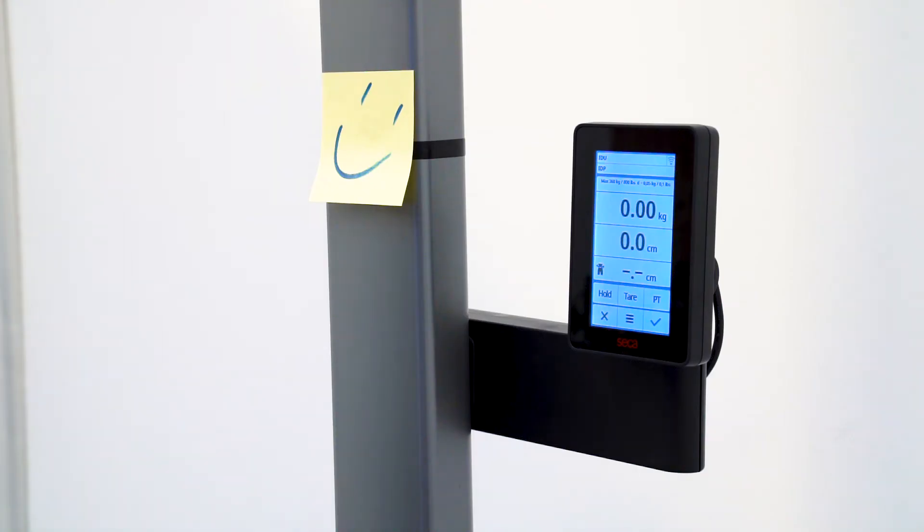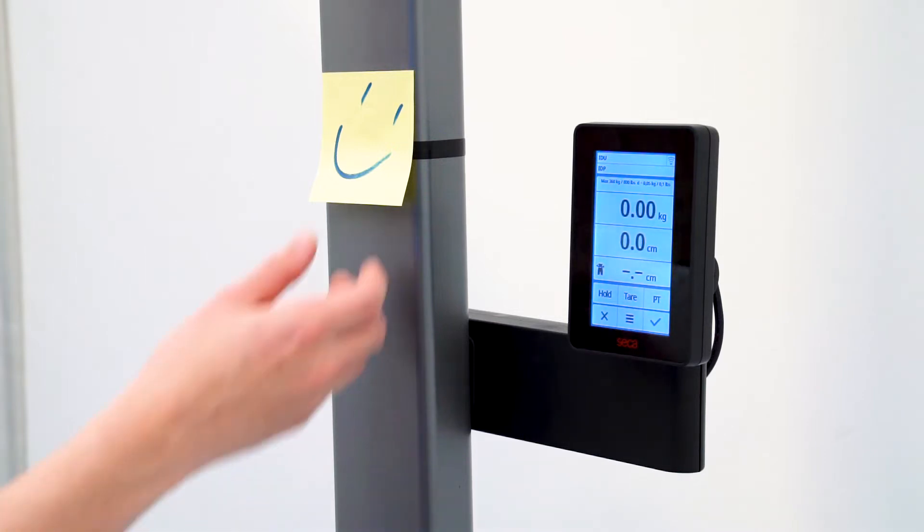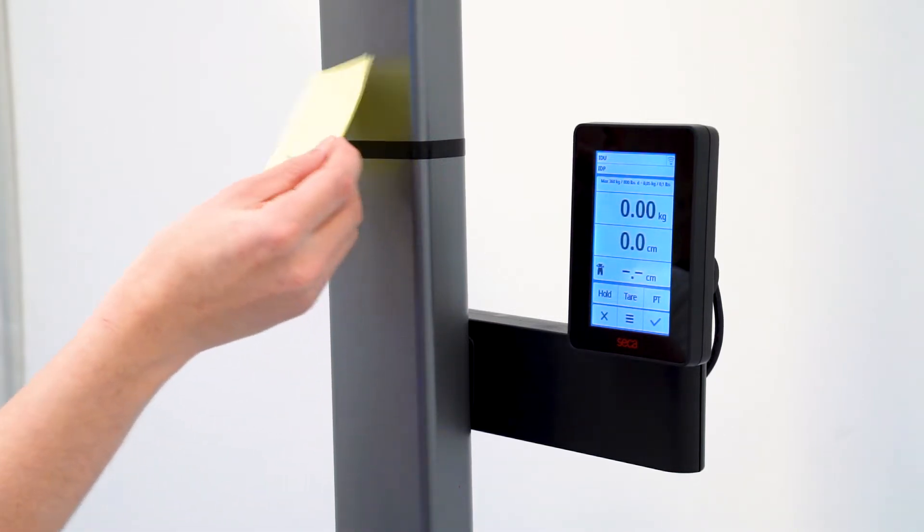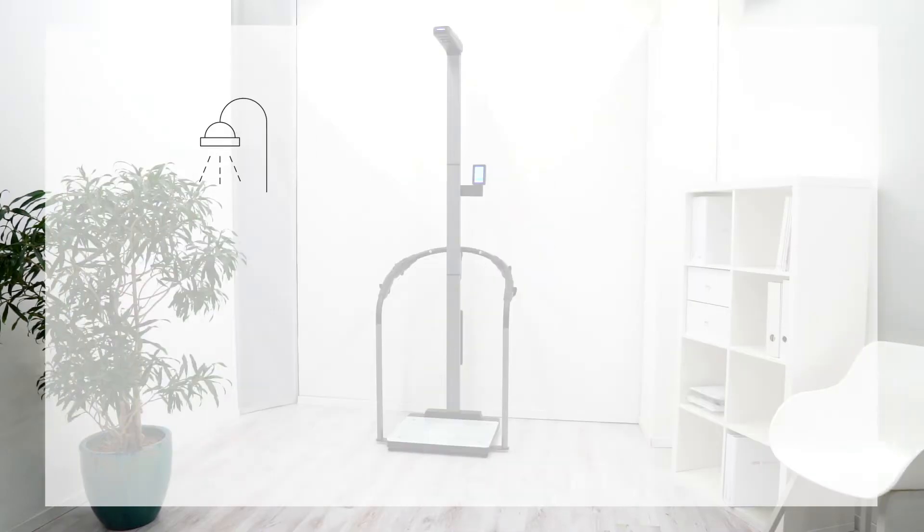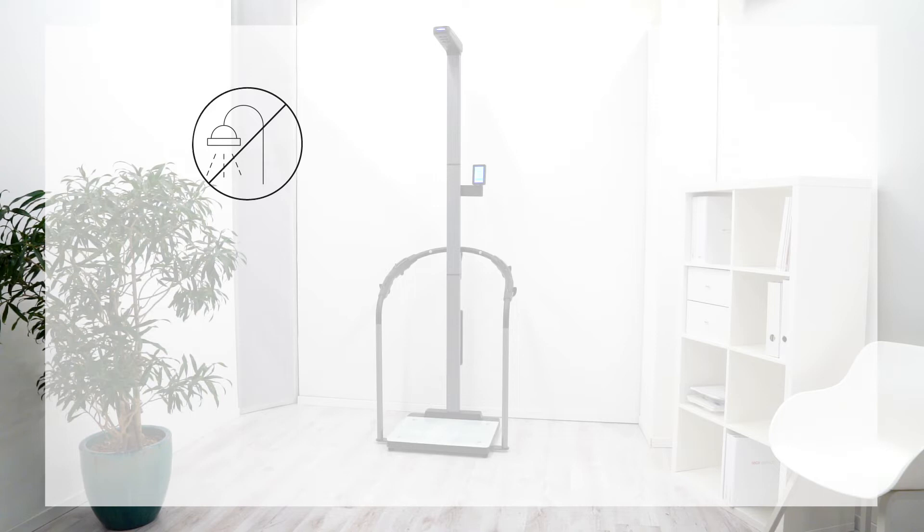Post-its, stickers, or other objects may not be protruding from the column. Installation in damp or wet rooms is prohibited.